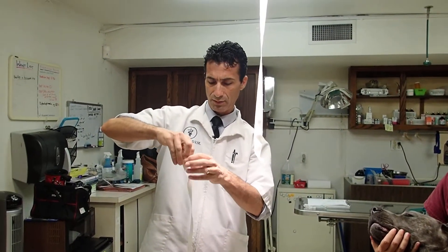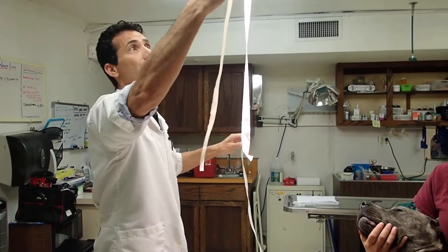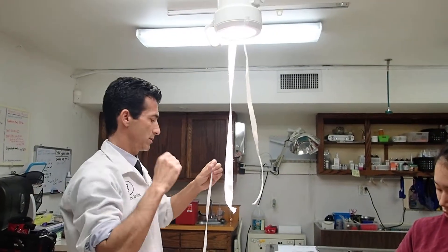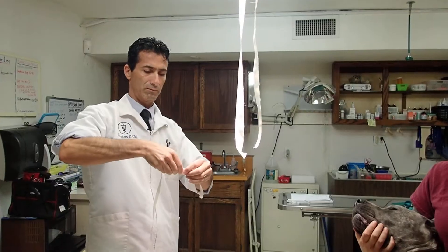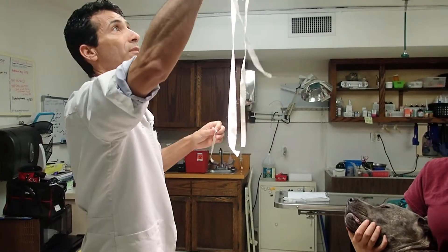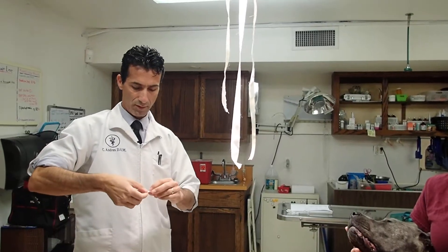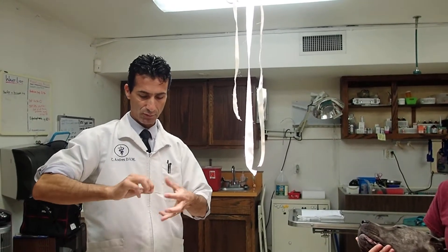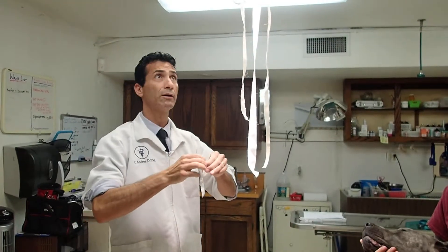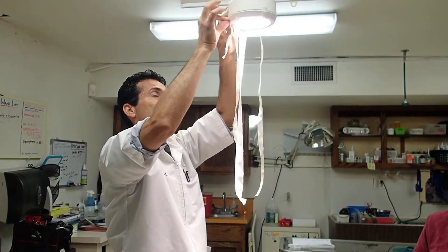I'm going to cut another strip that's about a similar length, then tear it in half so I have about a half-inch strip on each side — put one on that side. Then I'm going to take this last strip and maybe just tear off a third of it, and this one I'm just going to twist the middle, make it into a thin bow tie, so to speak. This will be what secures the T-port later.